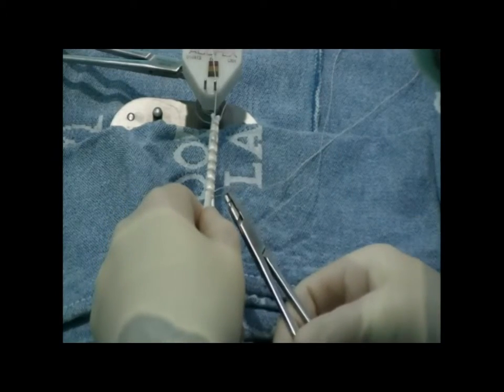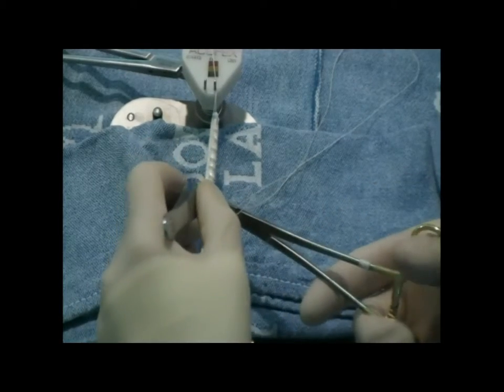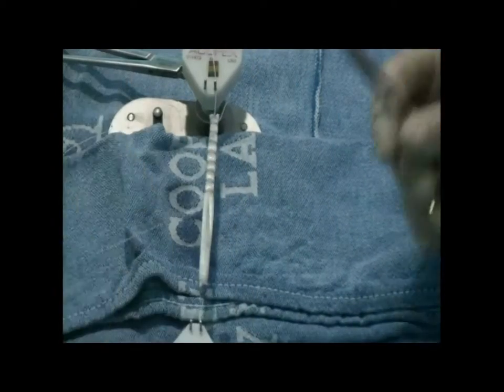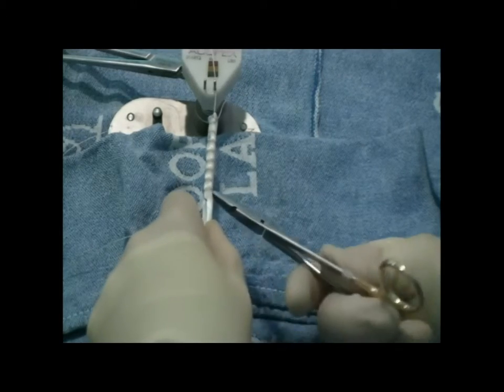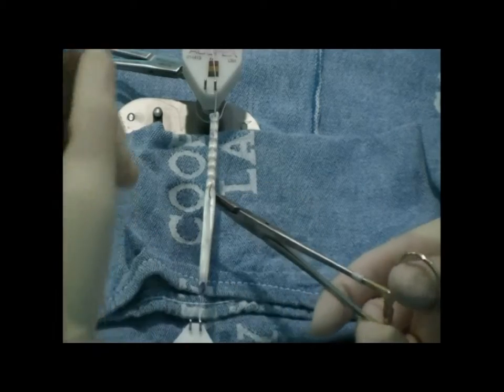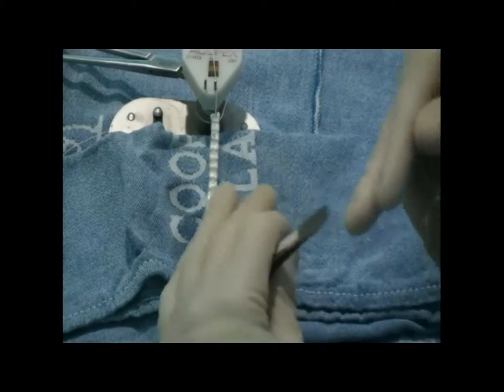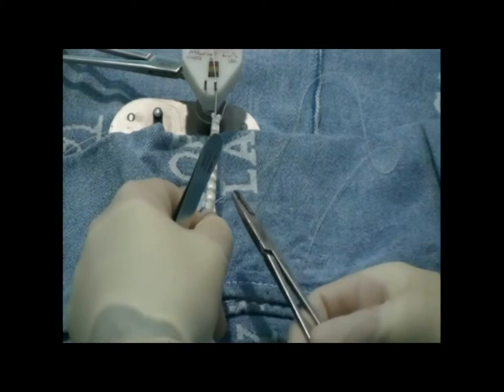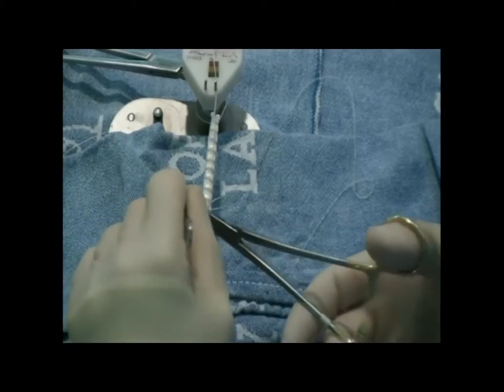This is just showing a running suture that we do from one side to the other. Bites are taken on the outside of the cylinder coming to the center, and then taking another bite on the other side. This running suture is non-locking and provides a nice compression of the graft as you go across. The key is you want to take your time with this — you really want the graft to be perfect because if it's loose or not uniform, you will deal with these problems later. You want the graft to be nice and compacted because then it's workable inside of the joint and won't fray on you.